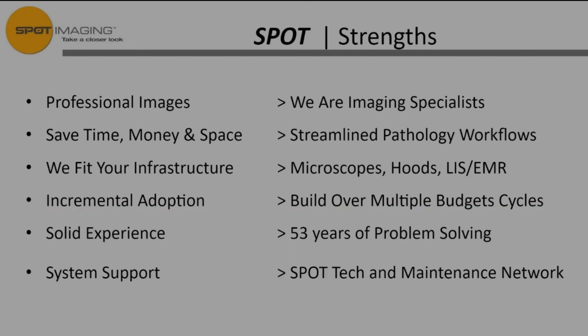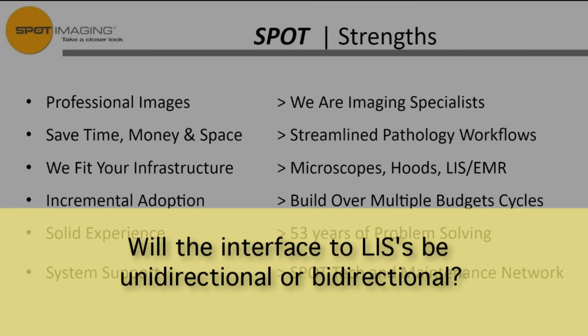From Toby Cornish. Will the interface to LISs be unidirectional or bidirectional? Since we're using HL7 messaging, it can be bidirectional. In the beginning, the first releases we think are primarily going to be unidirectional, with our data being uploaded into the LIS.